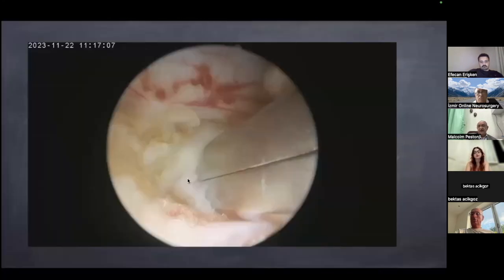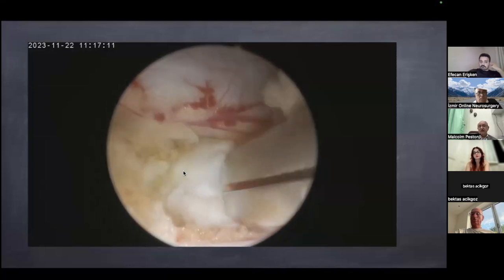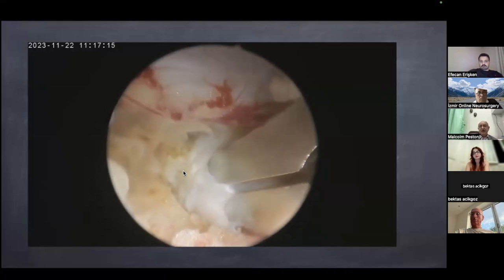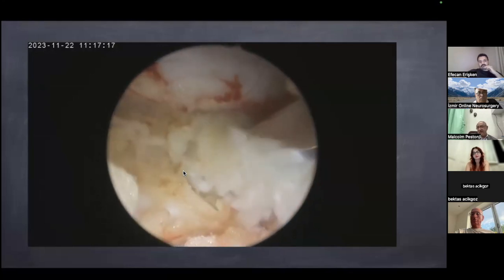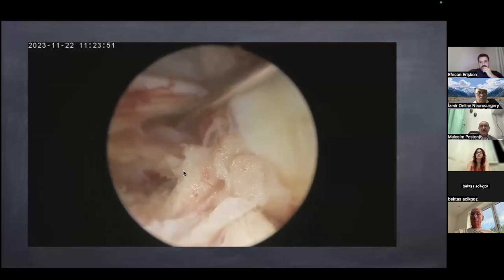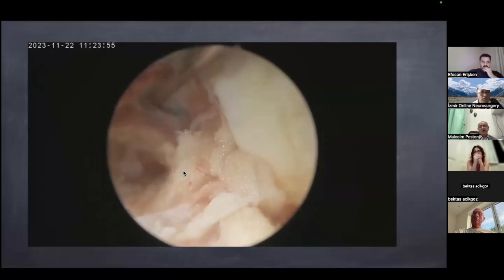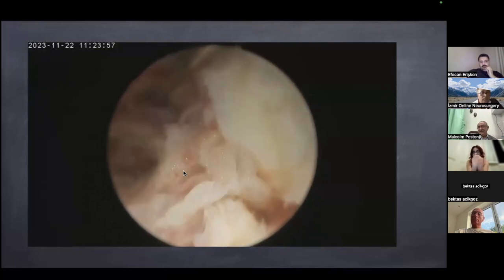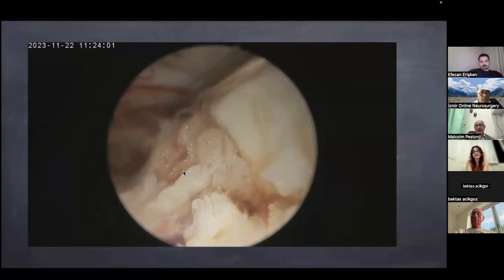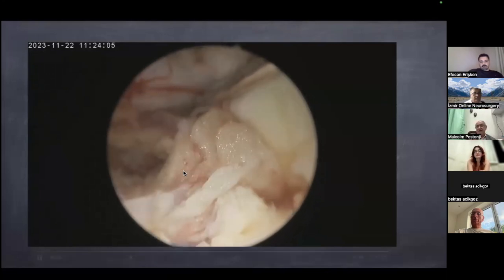See this video, gentlemen. A subligamentous herniation. We have cut the PLL. And part of the PLL fibers and the fragment are now being pulled out. And finally, I am looking below the dural surface. I feel it's adherent. I need to strip it. So I start stripping it. And when I strip it, you see something that is going to come up. You'll be shocked.